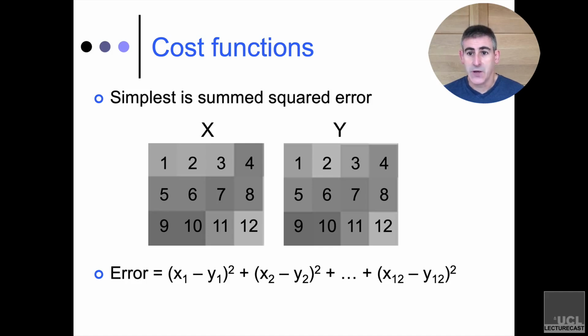That would suggest that there was no overall error when that's wrong. Whether it's positive or whether it's negative isn't important for us. It's just that they're not the same, and it doesn't make a difference what the direction of that error is. So as a result, we square these. And this is a simple error function that you've seen probably in statistics before.